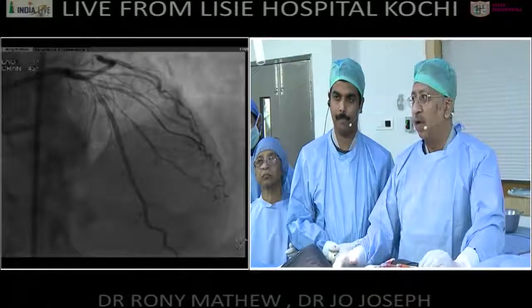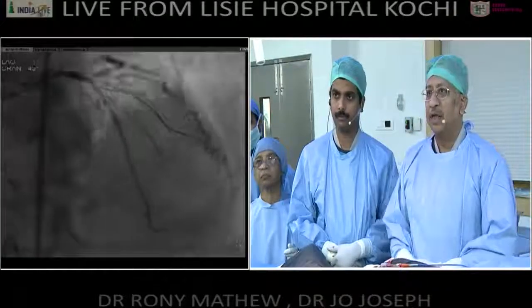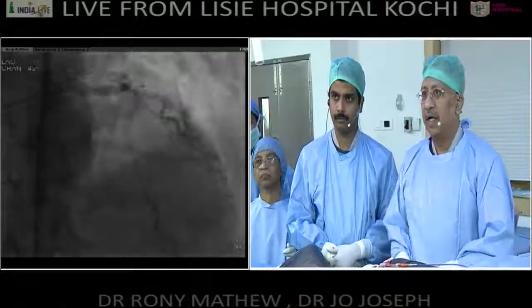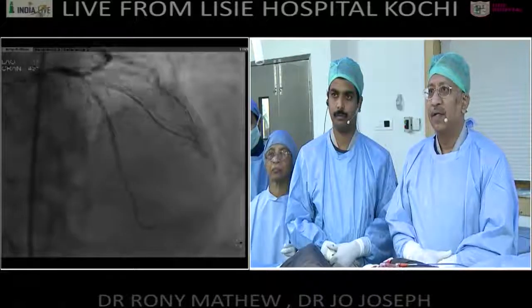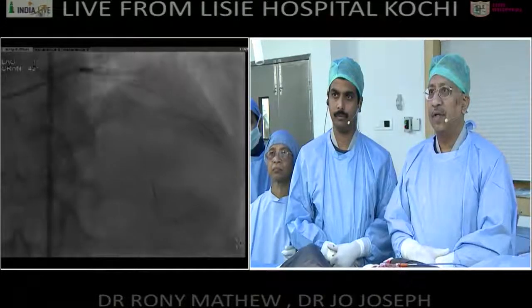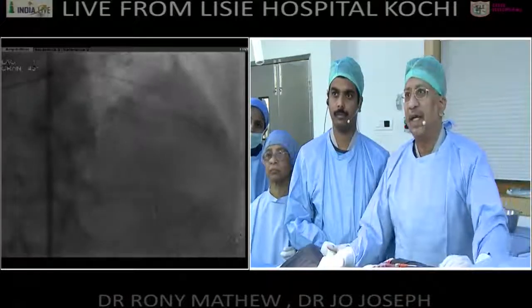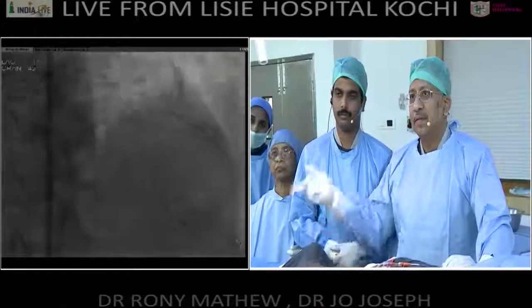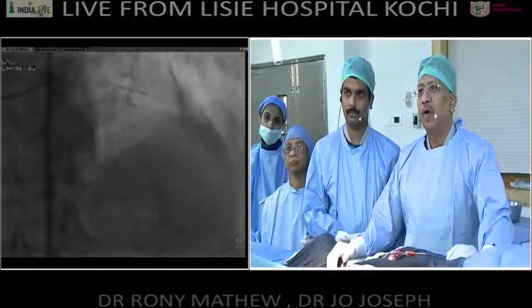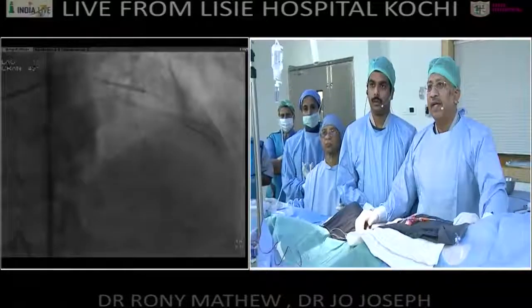So what I did is, go to the next shot. Okay, this is an OCT run that is being done, but as I told you, I'll go ahead and I'll show you the OCT after this. So that is me placing the stent exactly at the diagonal ostium. Next. We have inflated that.